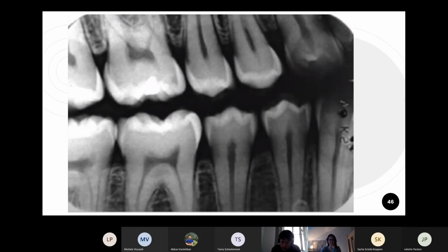All right, so this is a bite wing from a little bit broader perspective. We can see more teeth here. It's again on the right side. Yeah, I'll give you a few seconds to look over it, and then I'm gonna speak about what's to find.